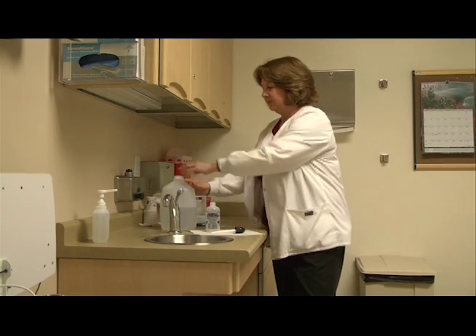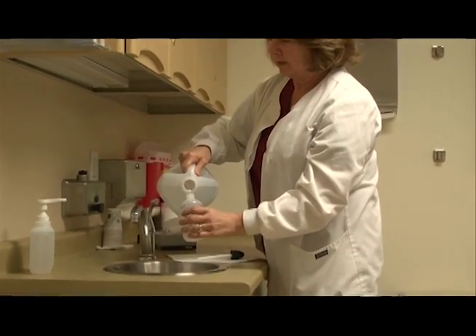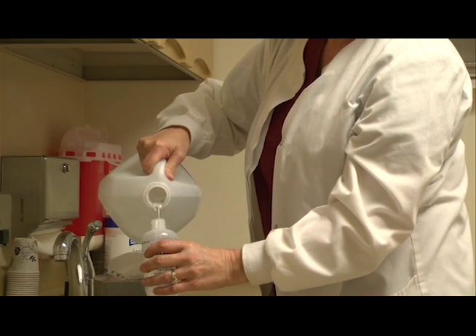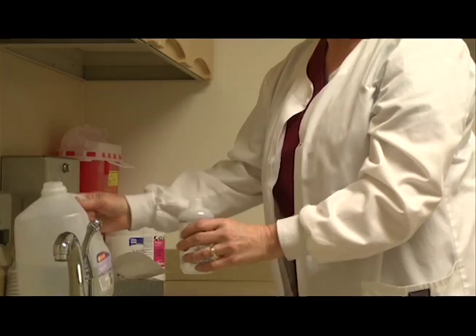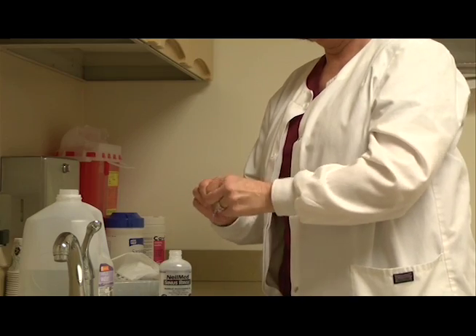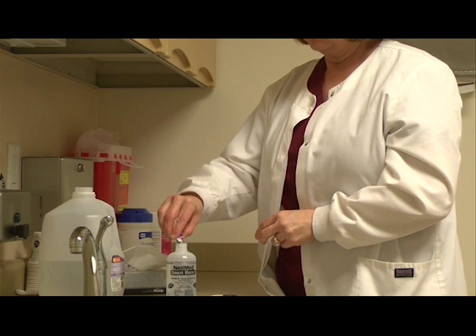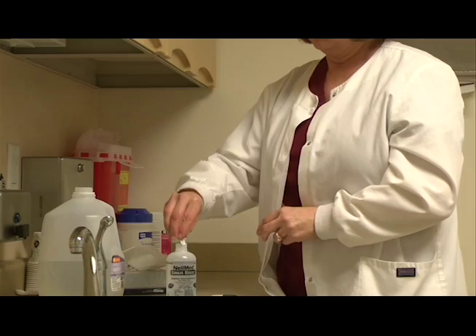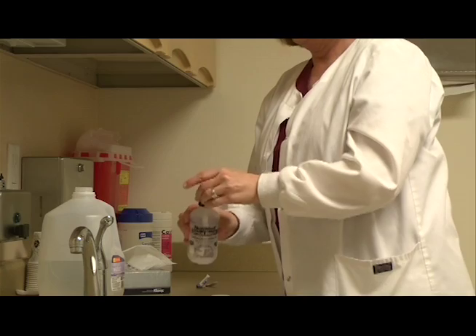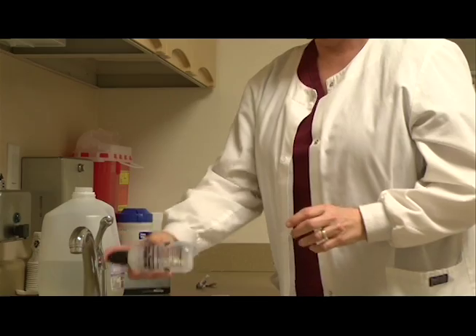Fill up the bottle to the fill line, which will be eight ounces of water. Some people like to warm it up in the microwave just slightly because it's more comfortable, but you can do it either way. It's important to use the whole packet — not part of the packet — because the ratio of salt to water needs to be a certain amount. Then put your finger over the hole and shake it really well.